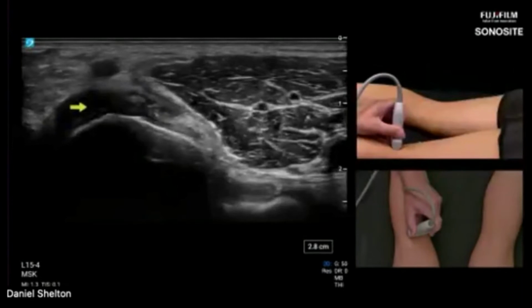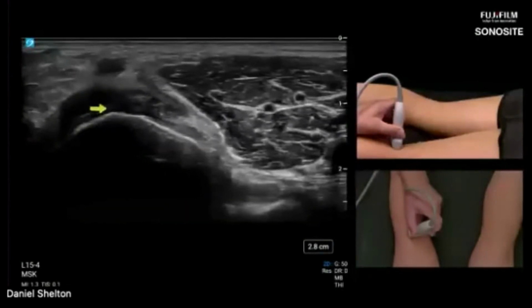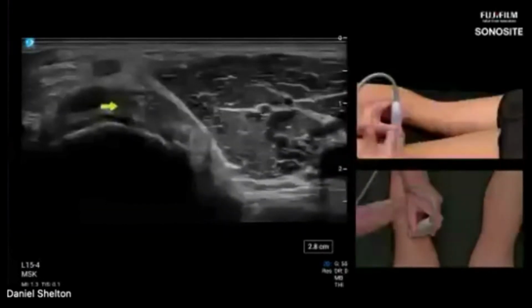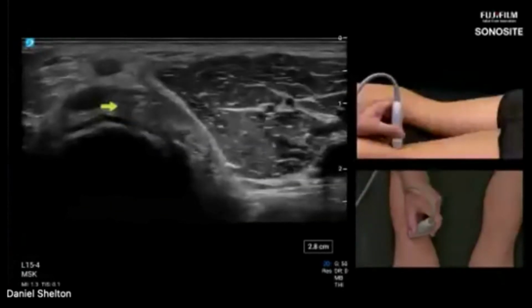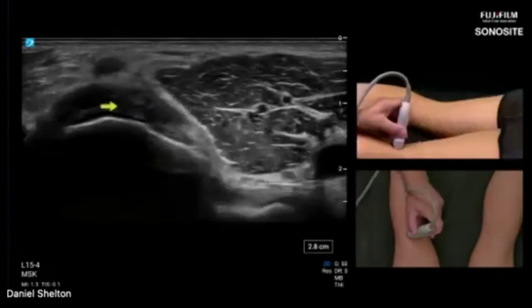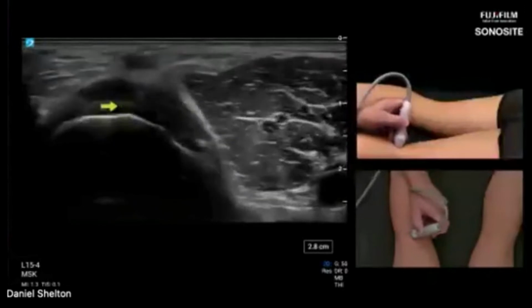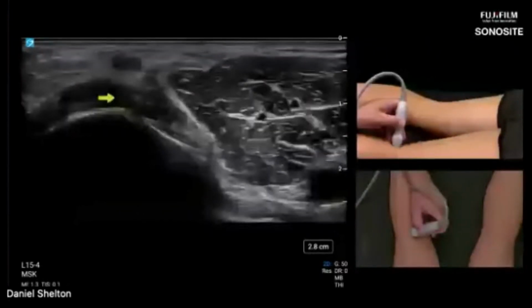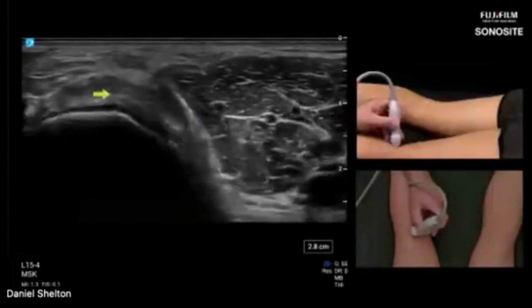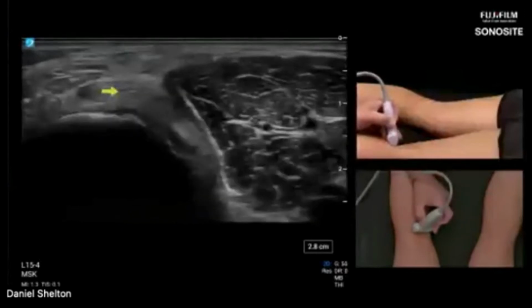I mentioned there's a tendon, semimembranosus attaches to the posterior tibia. And those clues that kind of give this away are the tilt of my transducer. So it's leaning back just a little bit, right? And then if I tilt the transducer the other way, will it brighten up or darken? So it didn't brighten up, it got even darker for me. So that tells me that that tendon right here is diving further away from my probe. So I'm going to tilt my handle more towards the feet and you'll see that brighten up. So that does confirm that was a tendon and not a Baker cyst right here.